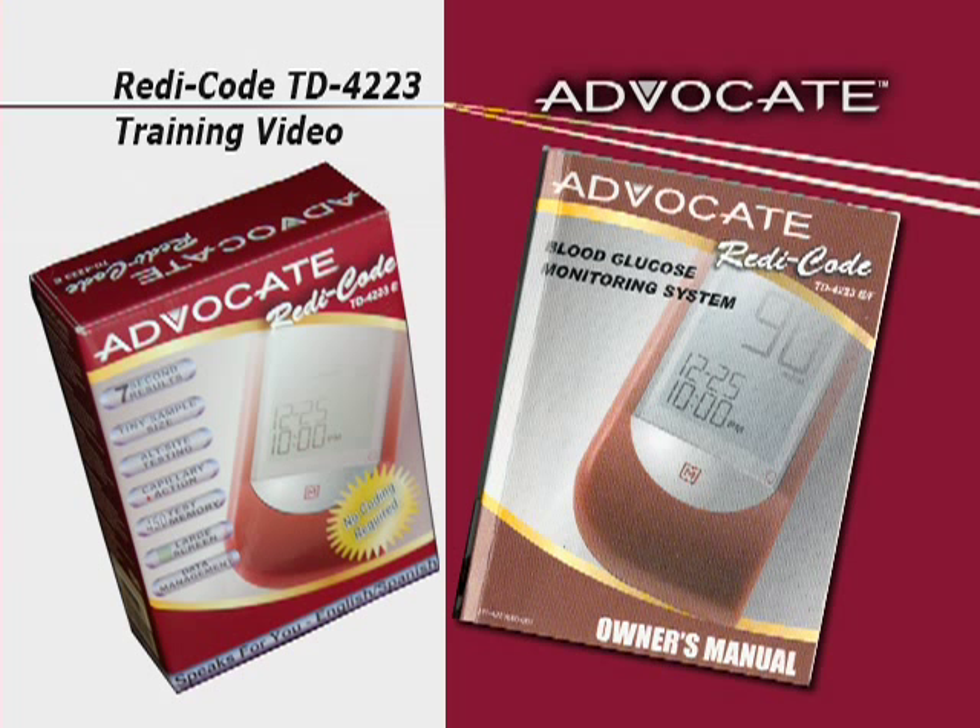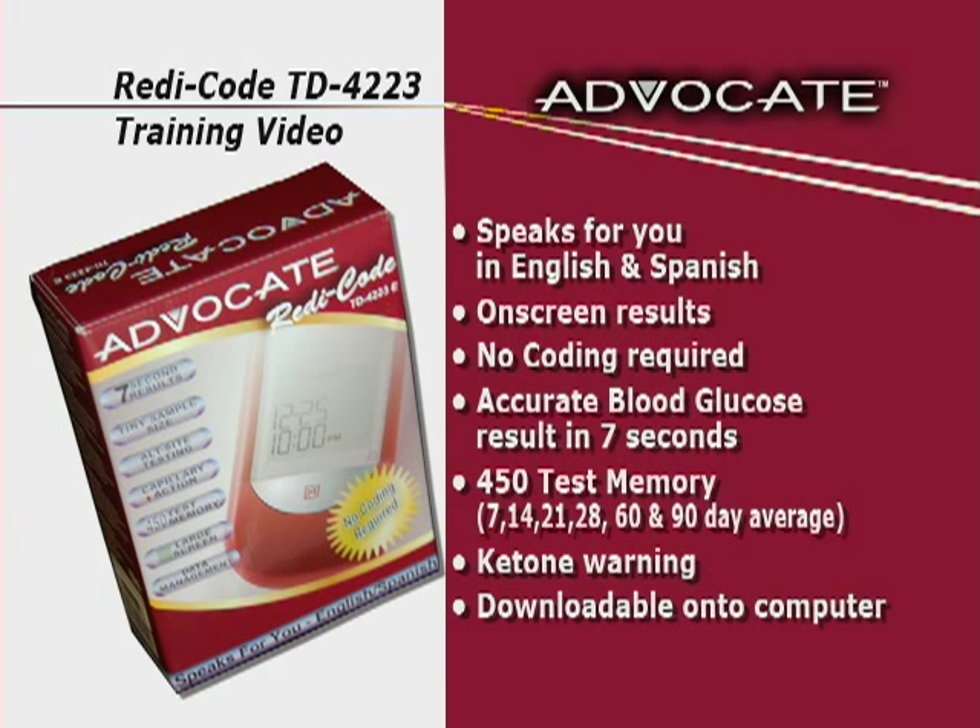Blood glucose monitoring plays an important role in diabetes control. The results you get with the Advocate TD 4223 system can help you and your healthcare professional monitor and adjust your treatment plan to gain better control of your diabetes.